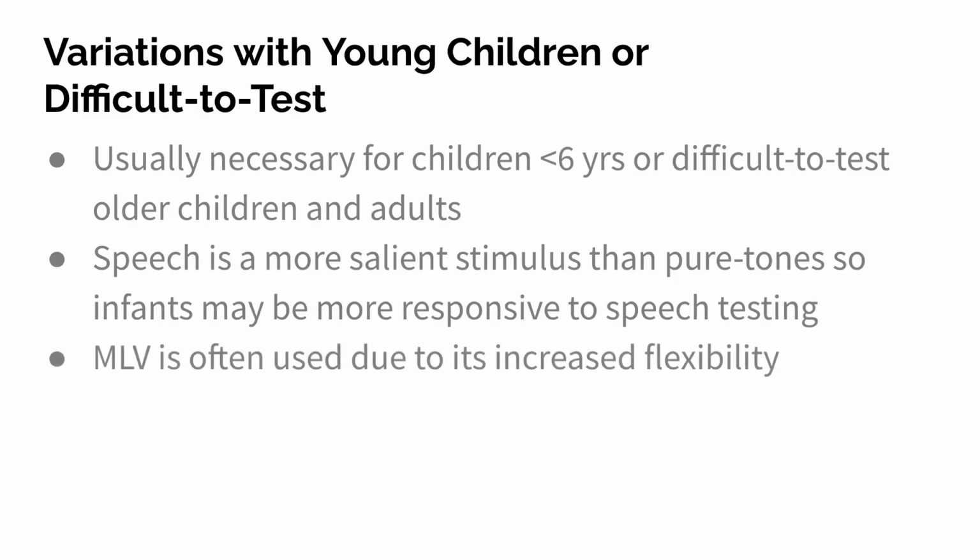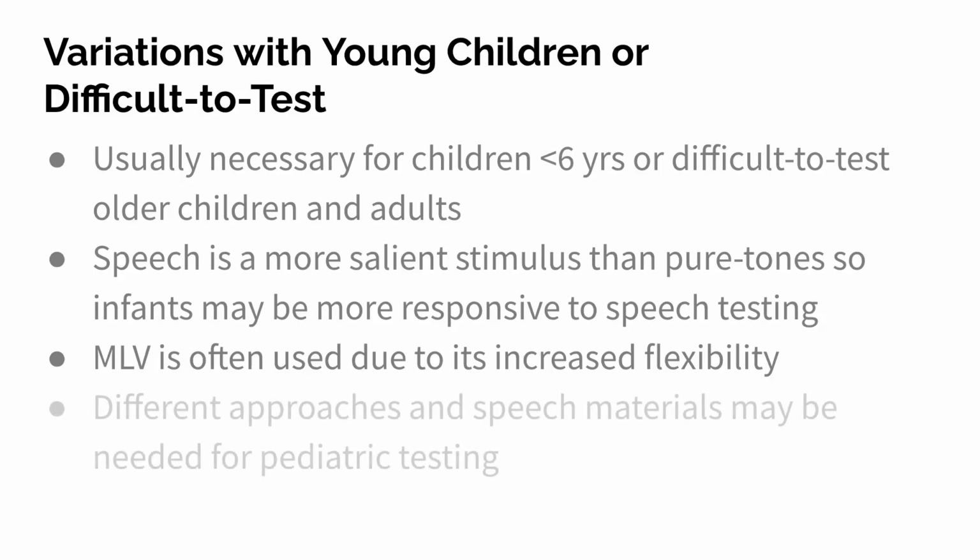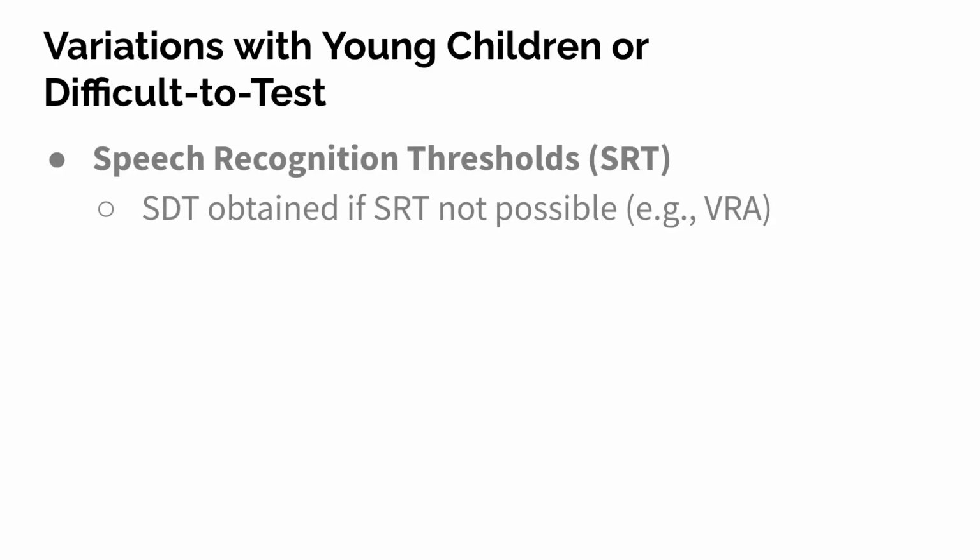You want to use monitored live voice for infants, for flexibility, and for young children. If you have a 2-year-old, you're probably going to use monitored live voice for any kind of speech detection threshold or speech recognition threshold. Different approaches and speech materials may be needed for pediatric testing. For speech recognition threshold, if you cannot get the SRT, like with VRA, you have to find an SDT. Yes, it's a lot less informative, especially in the sound field, but it's better than nothing.